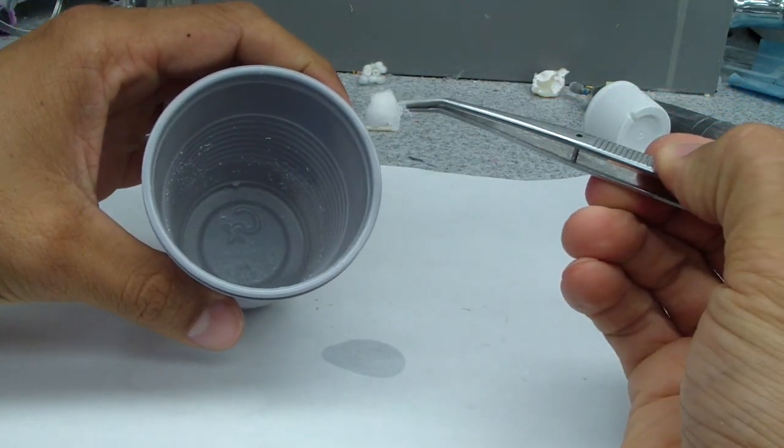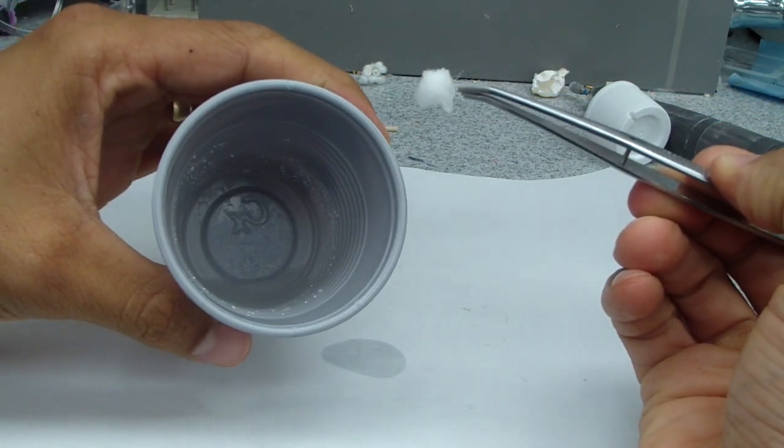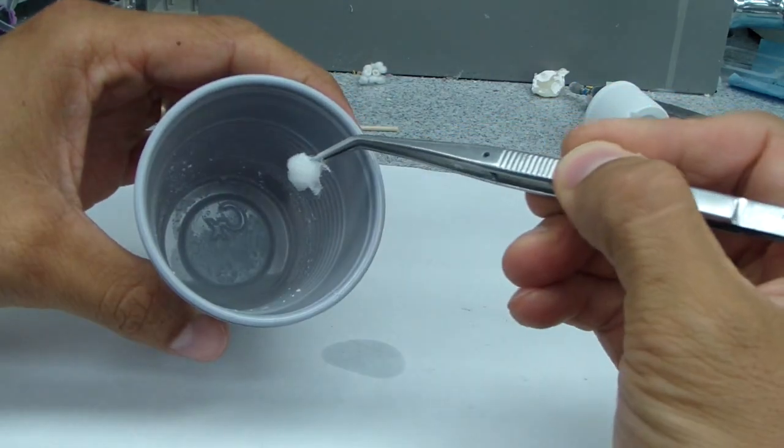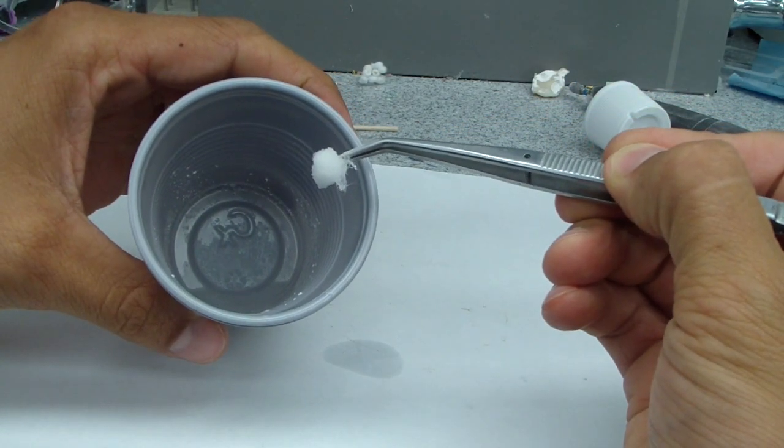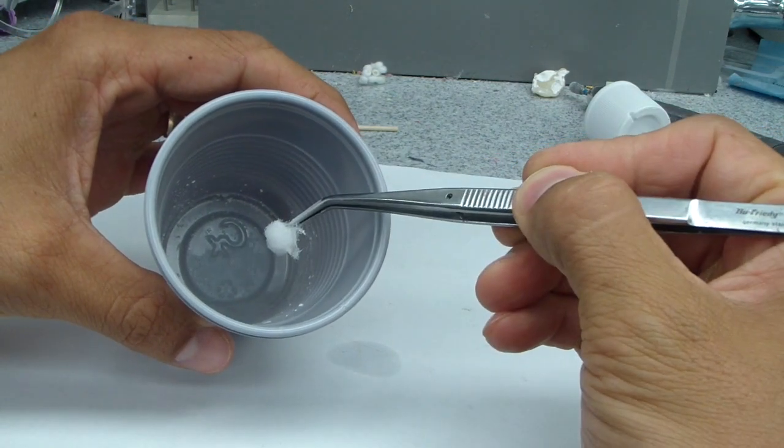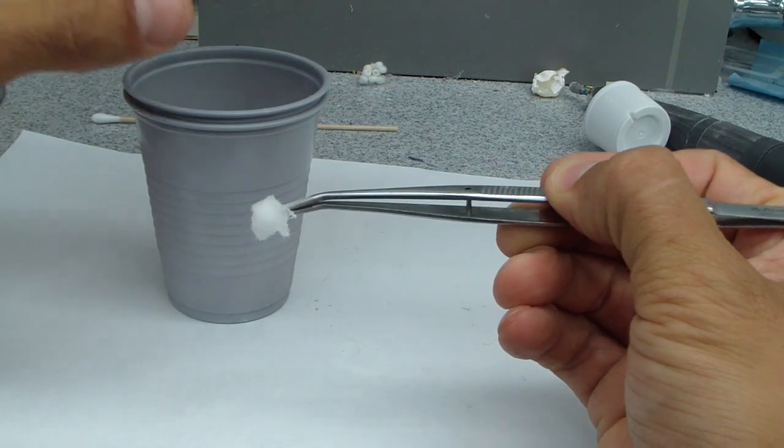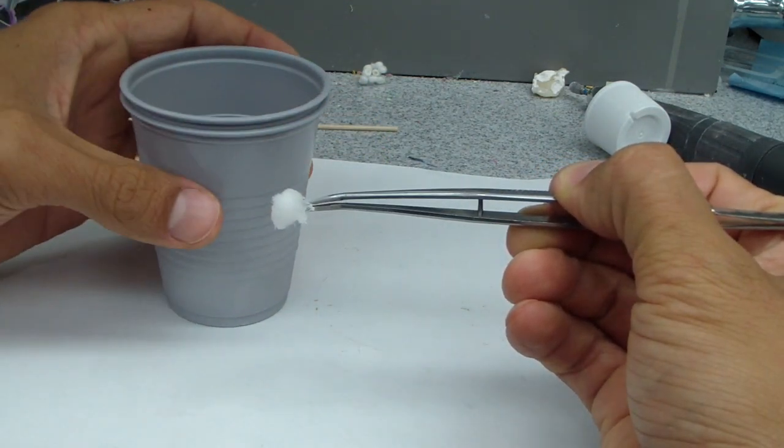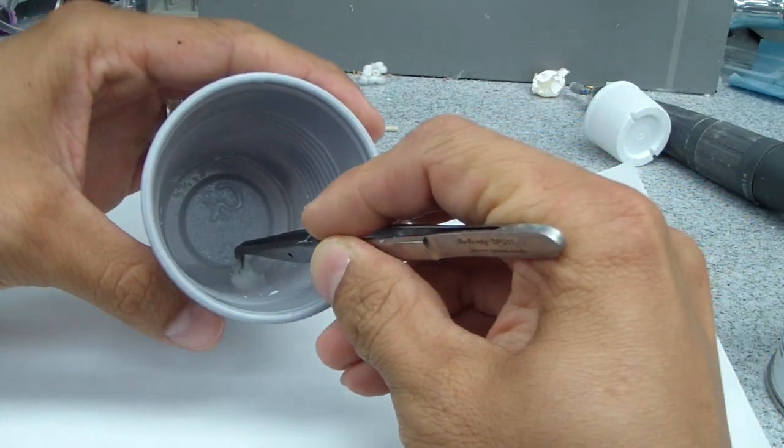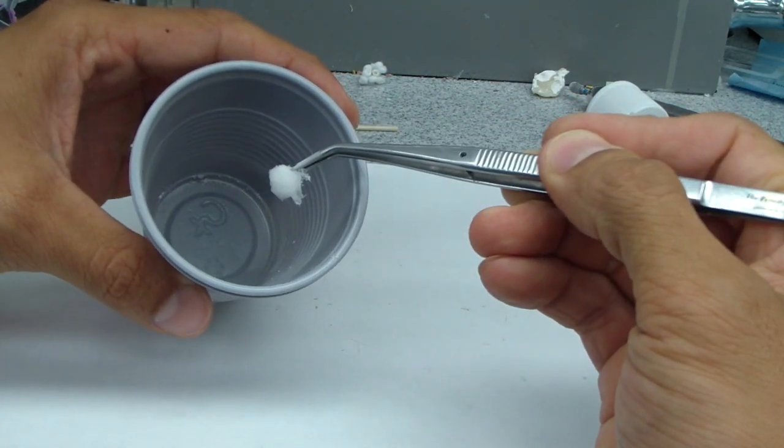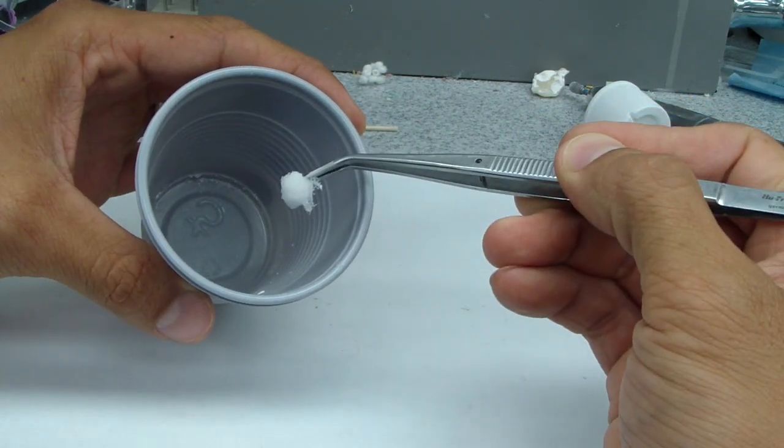But the thing is, when you're doing multiple teeth, you can preserve, this will, the liquid will keep in the bottom of the cup for, say, up to 30 seconds. So what we do in the residency is make sure that you use forceps, large cotton pellet, and then keep some in the bottom of the cup. This keeps you from spraying everyone. And then off you go do your cold test.